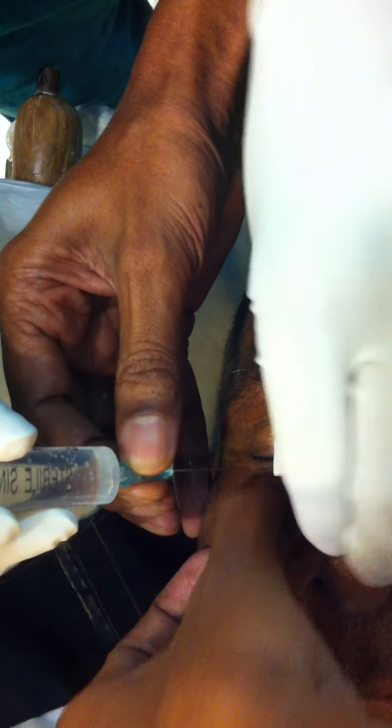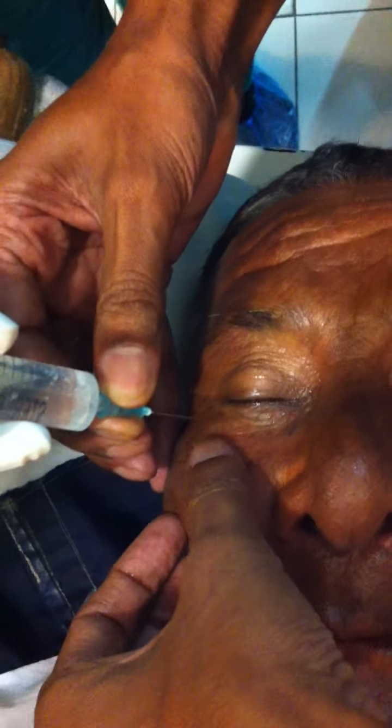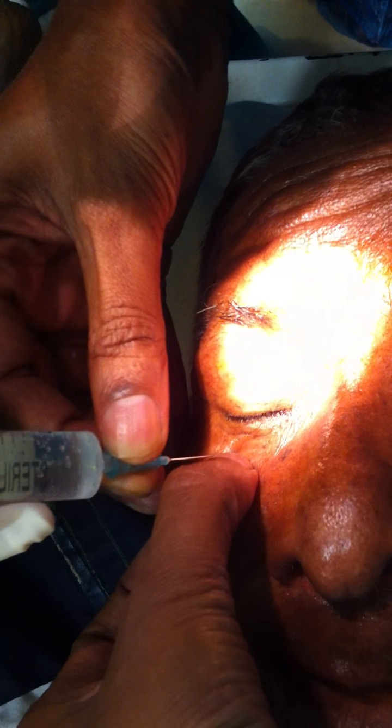Feel the orbit — remember where the orbit is. Now I will be holding my finger. So this is the bony orbit. From my nail, the needle is jumping into the orbit.